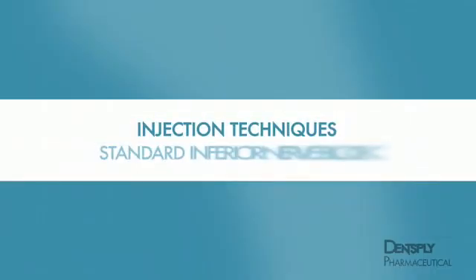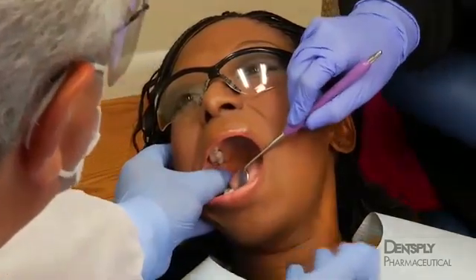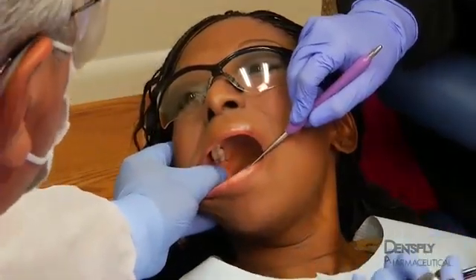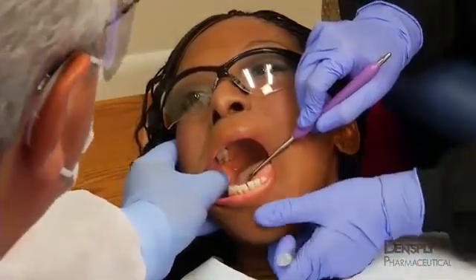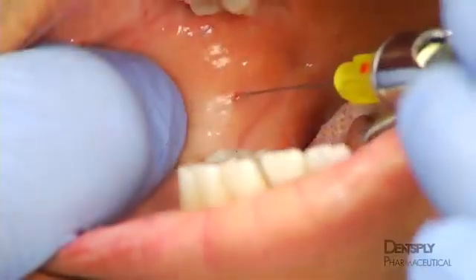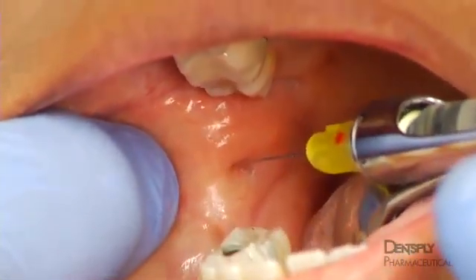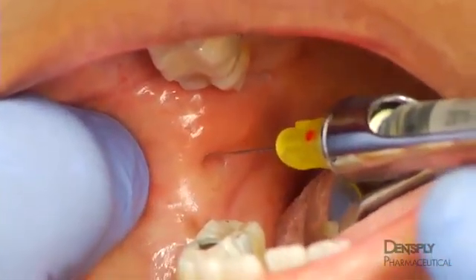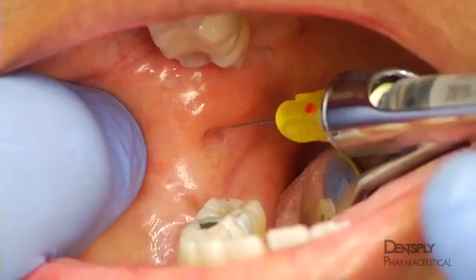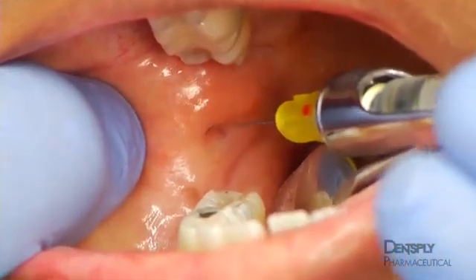Injection Techniques Part 2. Occasionally, modifications of the standard technique have to be made to achieve a successful injection. For example, during insertion, the needle may prematurely contact bone. This may occur when the patient has a narrow face, when the insertion point is more lateral than ideal, or when the barrel of the syringe is positioned too posteriorly over the contralateral teeth.